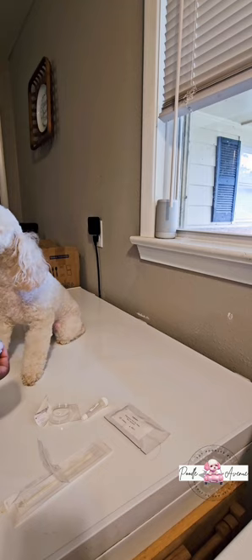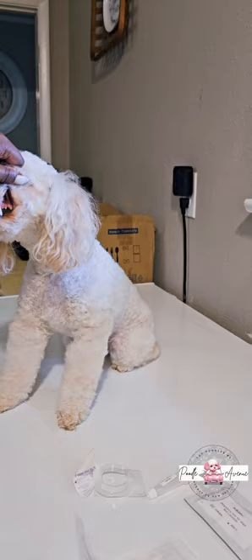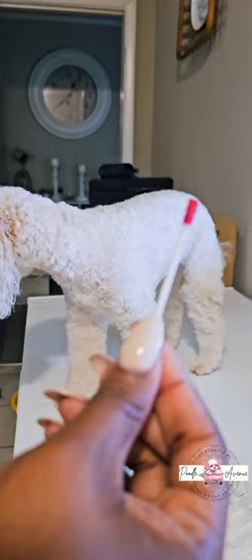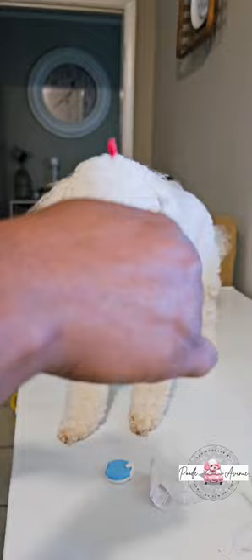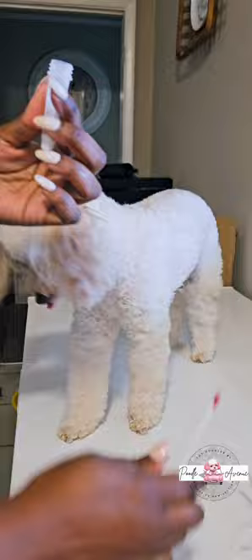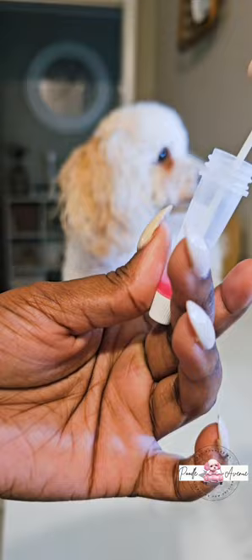Sit, good girl. I'm gonna pull her lip up like this — can you guys see that? I'm gonna pull her lip up and get in. I think we got a great amount of blood. We just swabbed her mouth. I thought we were recording but we weren't, so we're gonna open the buffer tube and swab around three to five times — one, two, three, four, five — and break at the breaking point on the tube. We gotta leave this in here for one minute.